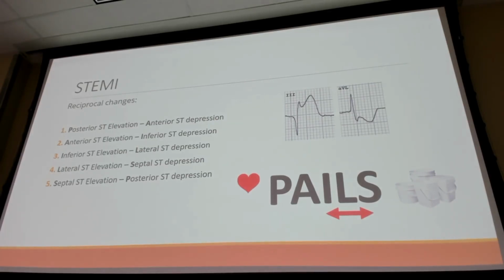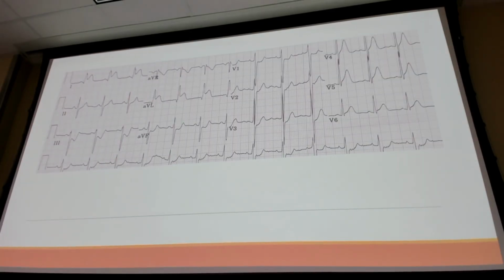So is it an infarct pattern on this EKG? The tricky part is, 30% of STEMIs might not have reciprocal changes. And we'll show some EKGs here that demonstrate that. All right, what do we see on this one?